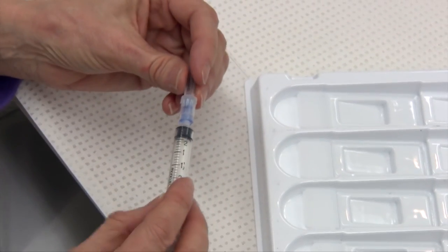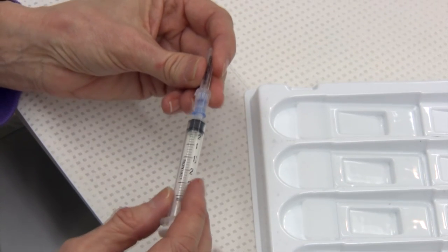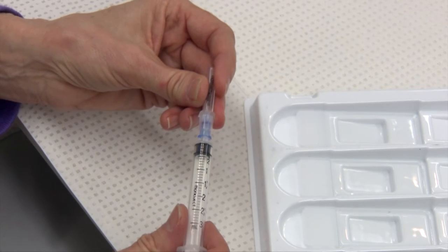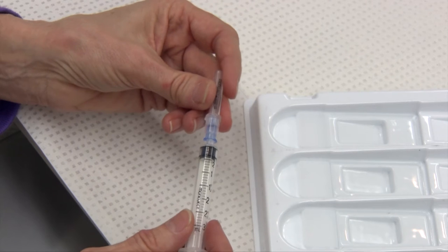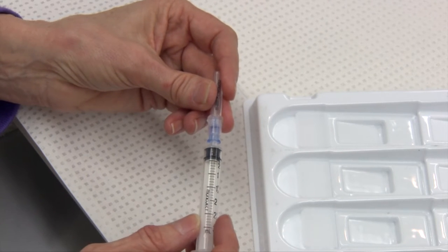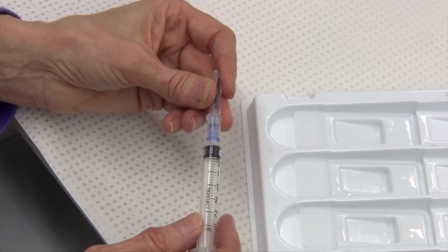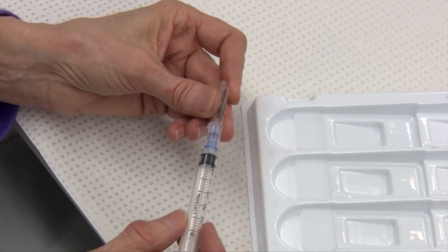Now that we have our fine needle aspirate performed, we need to demonstrate how to make cytology smears. These are usually done using a slide-over-slide technique, which I'm going to show you in a moment. Some people will also make smears as you would for a blood smear, and that can be used especially if you're finding cells disintegrate very easily when you're making smears.